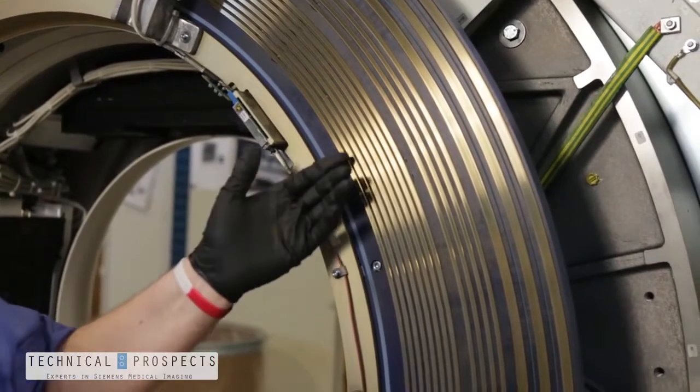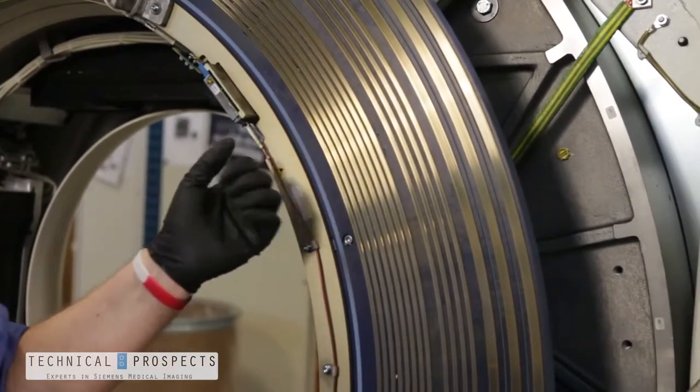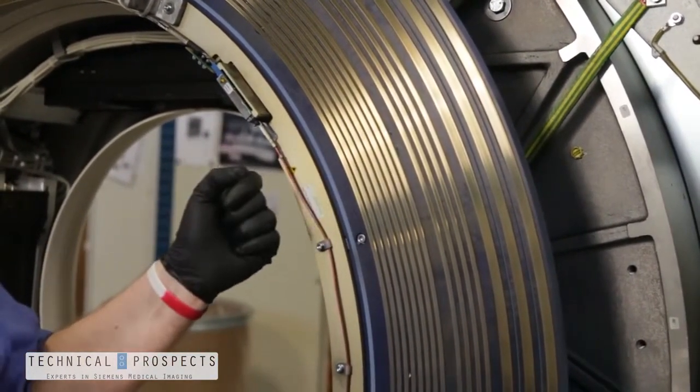The OEM recommends that we inspect the slip ring twice a year, a minimum of every six months during our PM cycle.